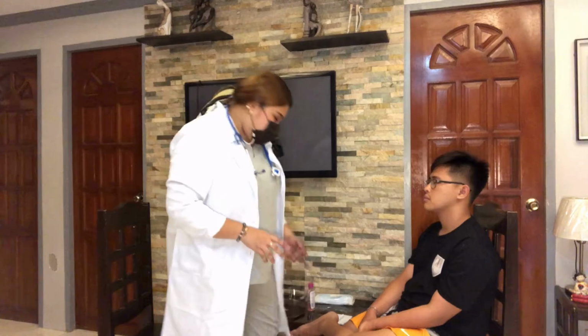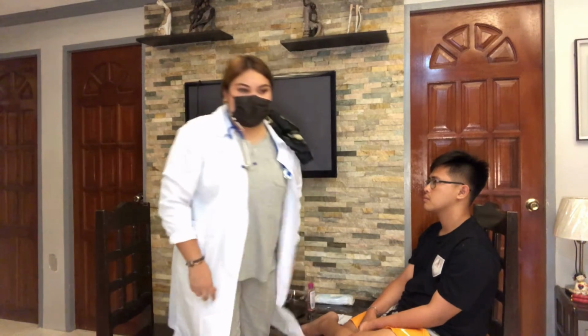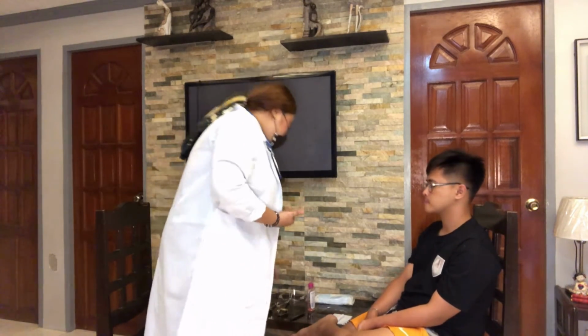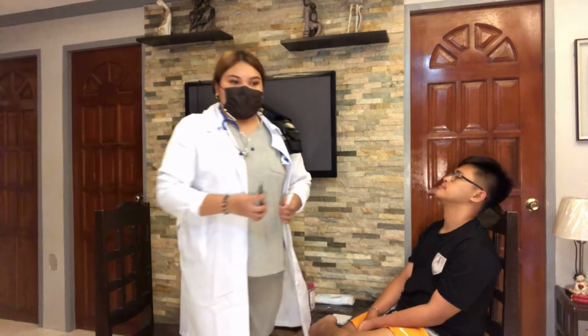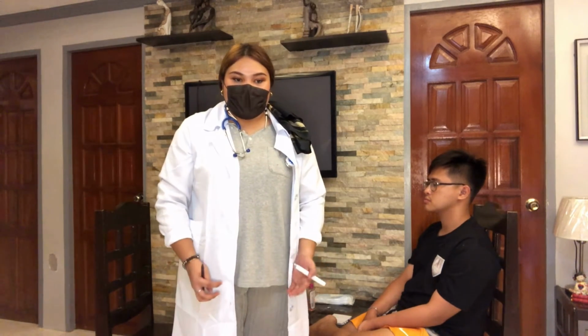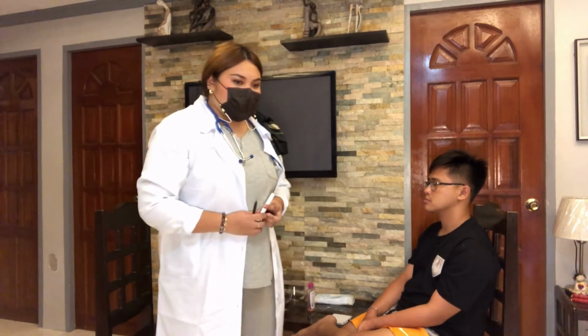And for assessing the nose and sinuses, we're going to use our speculum and our pen light. First, we're going to be conducting the health history. This includes allergies, difficulty of breathing, injury to the nose and face, any nosebleed, any medication taken, and we will position our patient comfortably.